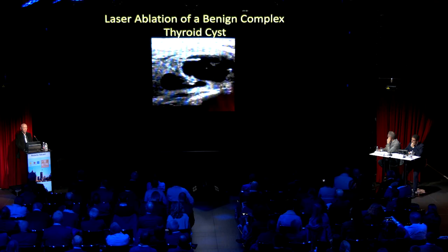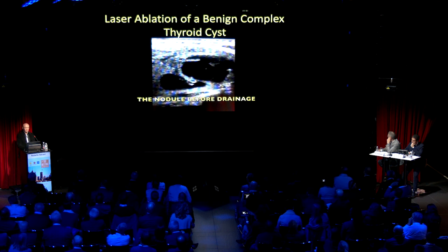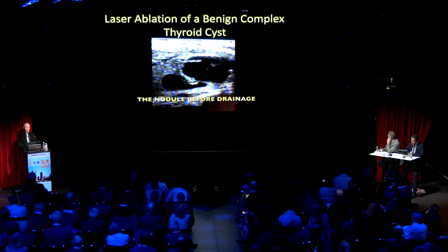So it's interesting, and I will show you a video in which I used the laser for a large complex thyroid cyst, which was septated. This is a true septum, and this is the needle. And okay, it starts.